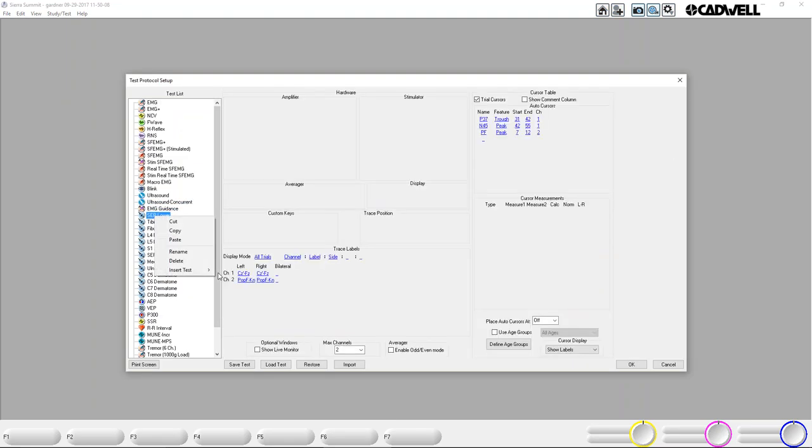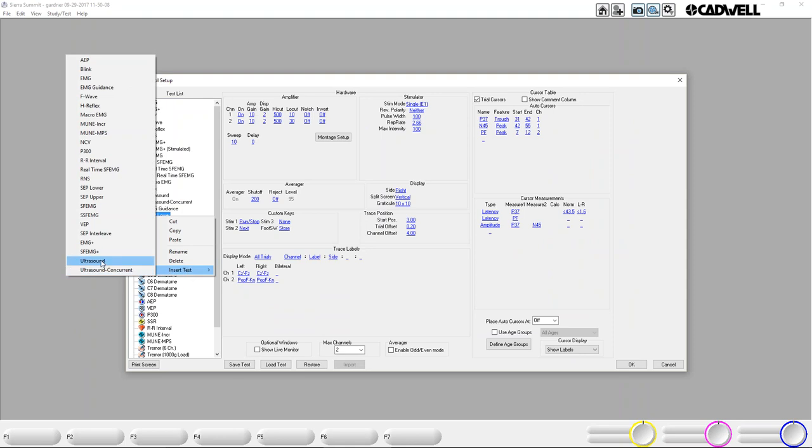Just like any test, you right-click, insert test, and here you'll see Ultrasound and Ultrasound Concurrent. We'll go over those two modes, but you'll want to add both. It's not necessary to add both modes — if you're in a doctor's office that you don't think will ever use concurrent, you might as well keep it simple and just load Ultrasound. Once you explain the difference, they may know right away whether they're going to need to use ultrasound concurrently with the EMG or nerve conduction software. That can be up to you when you do the install.